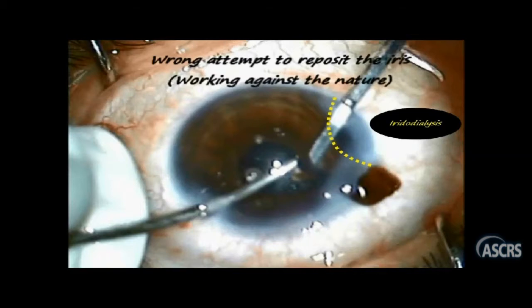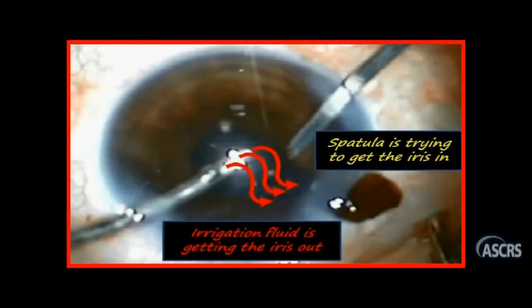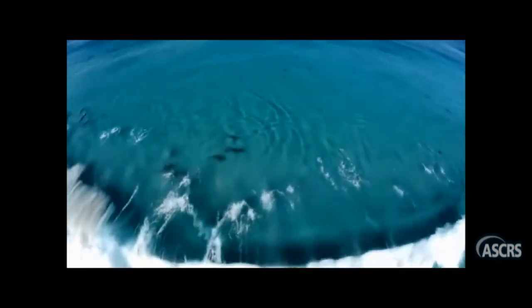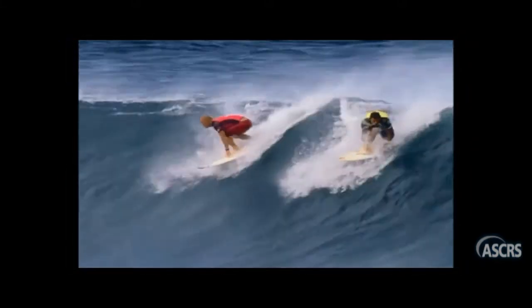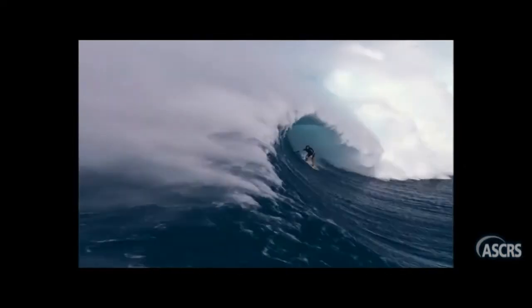Let's focus on the mistake the surgeon made. She went riptide by pushing the iris with the spatula against the irrigation fluid current, which goes against the instinct we are all born with. We see it everywhere around — dolphins, for example, never go riptide, they always swim with the waves. Human surfers always go with the direction of the wave, never against. And that's what our surgeon now knows for sure.